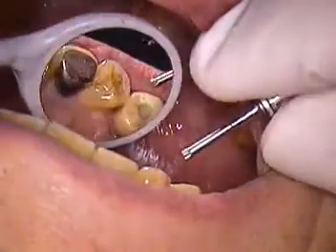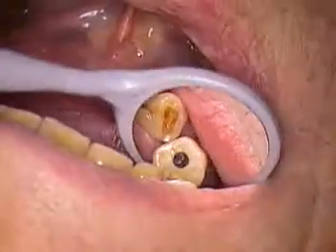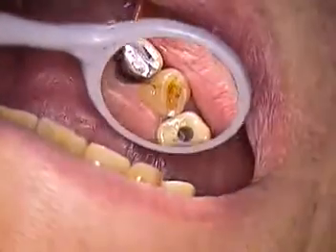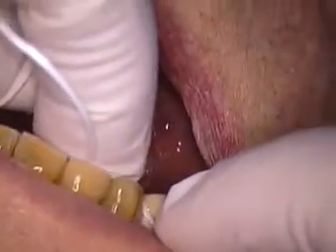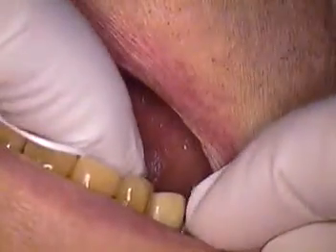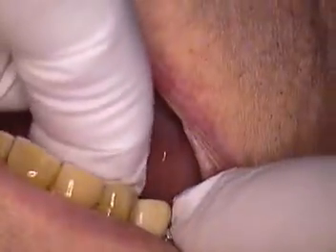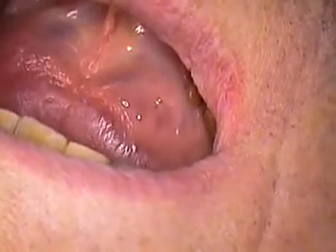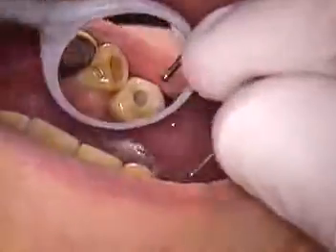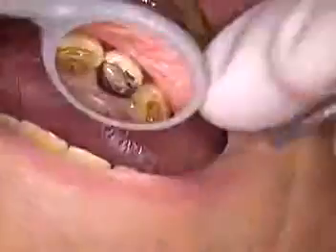We will not adjust the bite until we torque it down, but we could check it. Hold that. Snap the floss through — still consistent. Now that's shredded a little bit on the distal, and it might be a little too tight. I haven't tightened it all the way down yet. So let's continue to hand tighten and see if that distal will lighten up. More than likely, we have a tight contact on the distal.